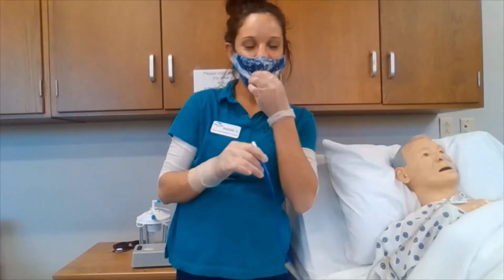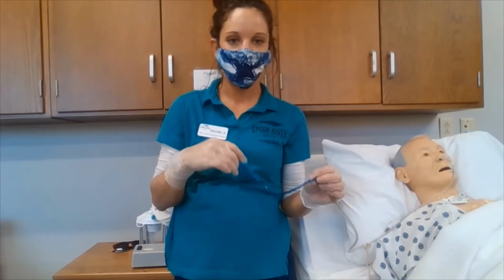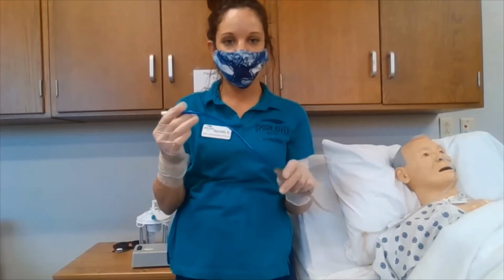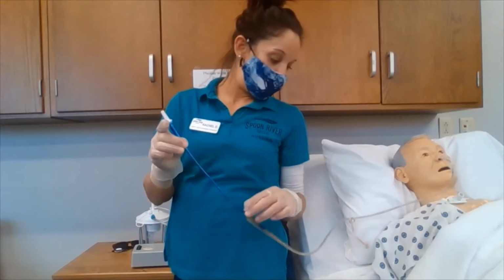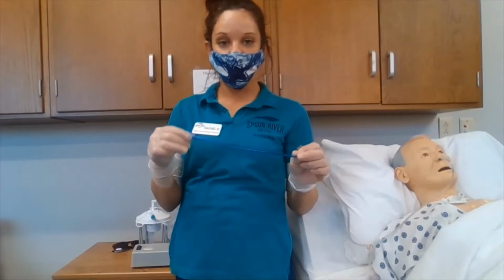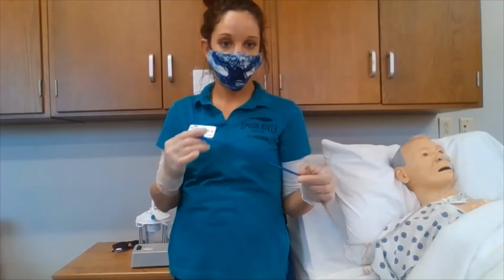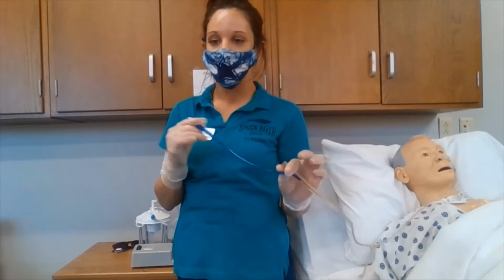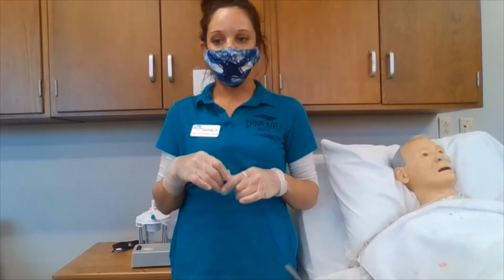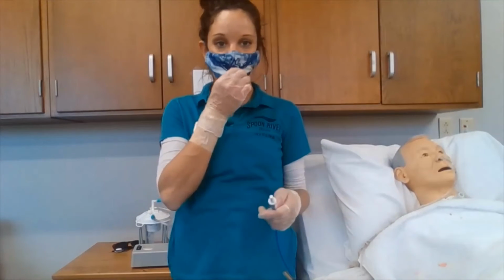Okay, for nasogastric removal, we are going to be checking the client's history, confirming that the order is in place for removal. If we are removing a feeding tube, then we are going to wait 30 minutes after the last feeding to remove it. We are going to make sure that our patient is sitting upright in high Fowler's position, make sure that we are draping the patient with a linen saver. We want to make sure that we have a plastic bag for disposal.